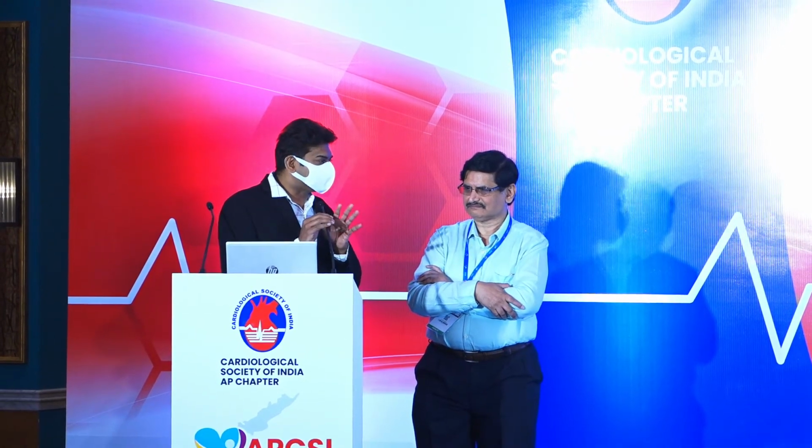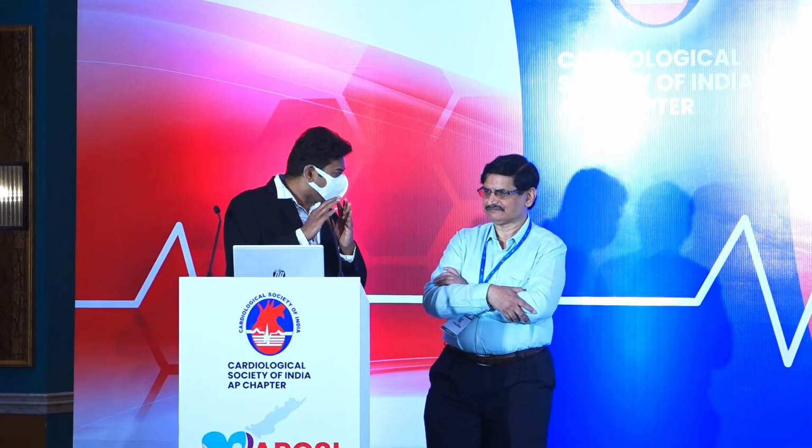And saline contrast, I have given total saline without any contrast at all in 5 cases till now, and I had a good imaging result. And as you were telling, the problem would be only where you have a large vessel. In a large vessel, I couldn't clear the blood properly. But if it is 2.5 and 3 mm vessels, it would work.